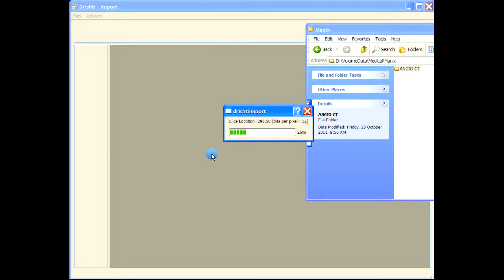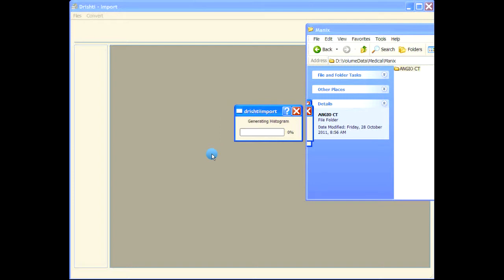To get the slice location and then sort all the slices based on the slice location. In case of standard images, it will just take the directory listing and then just take all the files based on the directory listing. So first file in the directory listing will be taken as the first file in the image stack, and same for the last file.